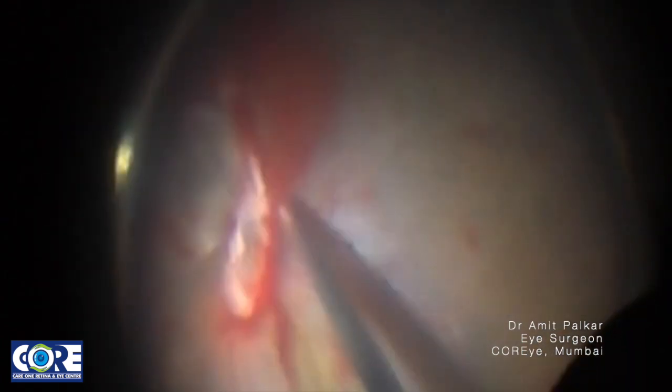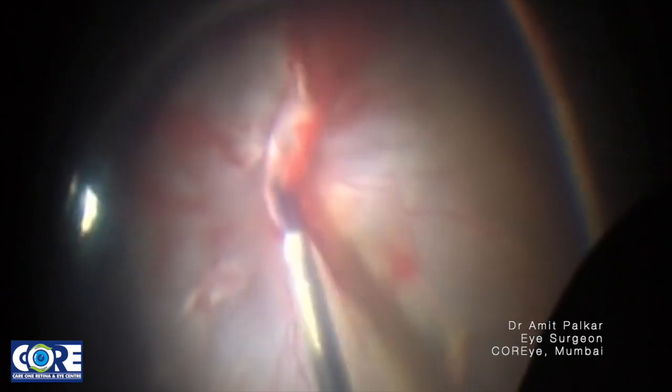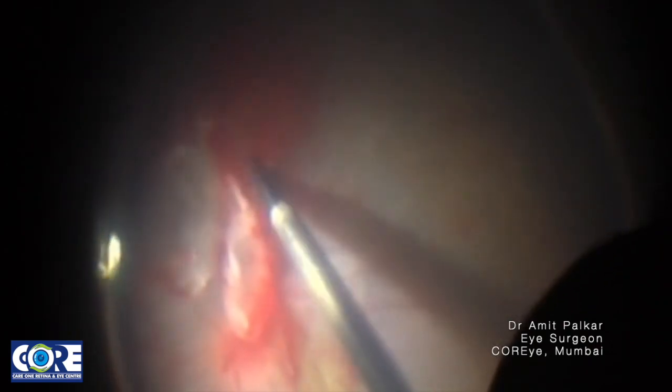but it's good to excise it as much as possible. Just a nudge with the forceps so that it gives a good peel. That's how the heme forms a thick layer on the retina, which is very difficult to remove sometimes and causes iatrogenic damage most of the time. One has to be very careful while peeling such membranes.